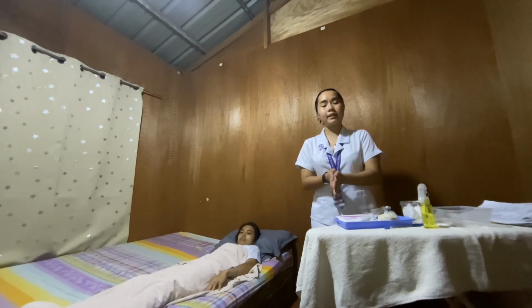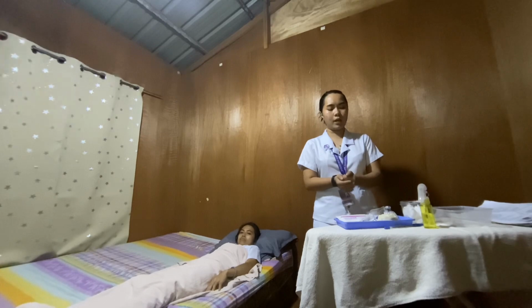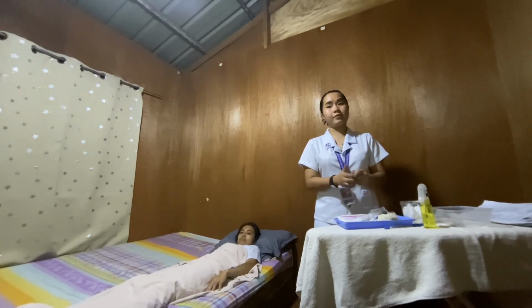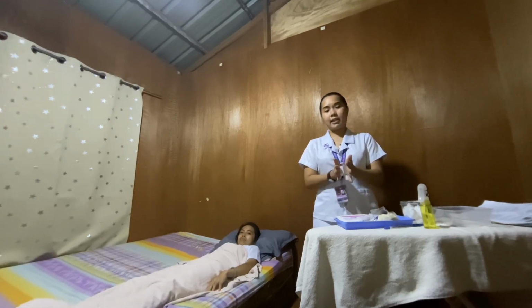After doing that, what we're gonna do next is to prepare the medication vial for drug withdrawal. We mix the solution, if necessary, by rotating the vial between the palms of the hands and not by shaking.